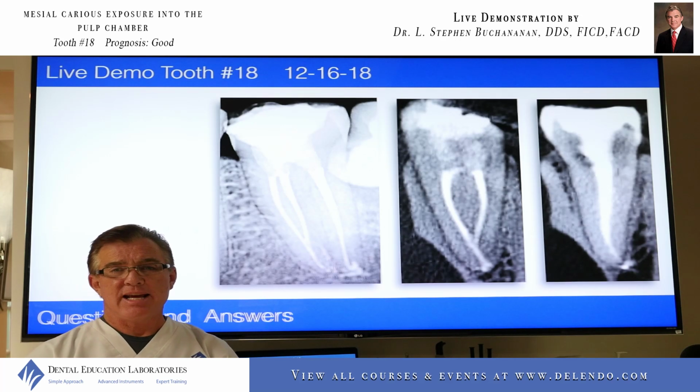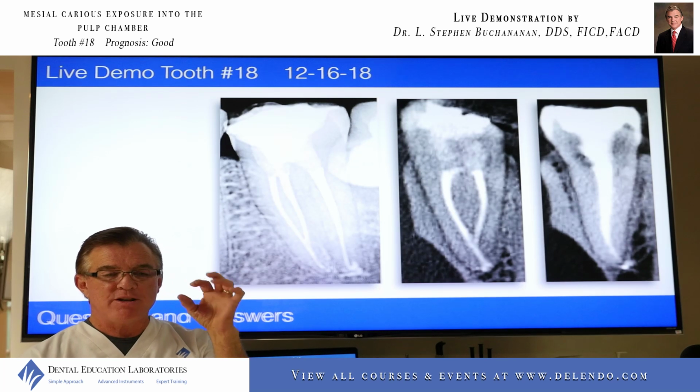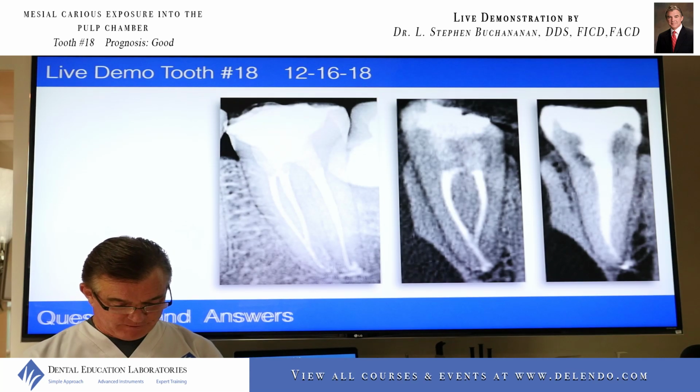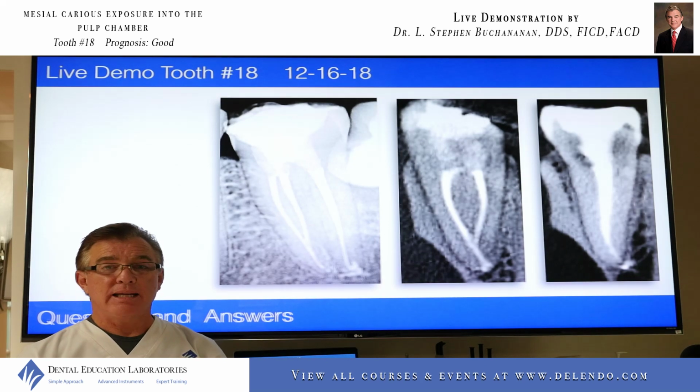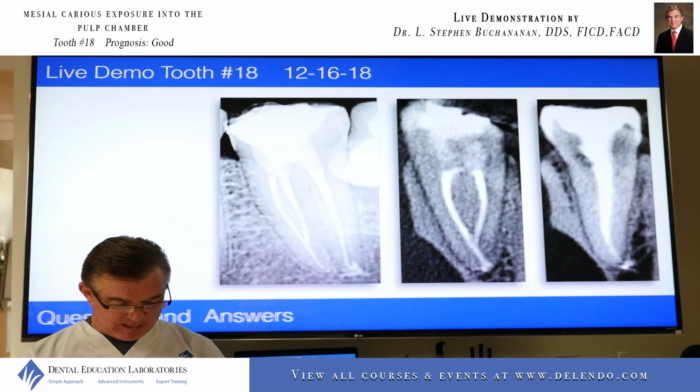Both of the cones in this case stayed exactly where I expected. They simply scooted a ½ millimeter, so they ended up right at length. And the puffs on the mesial and distal root are from the accessory canals. But anything at all in the IA canal is obviously bad.